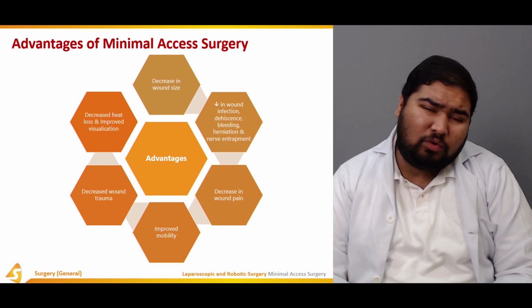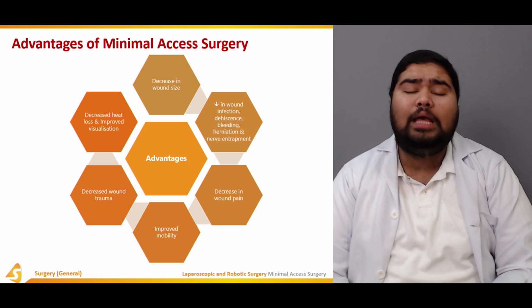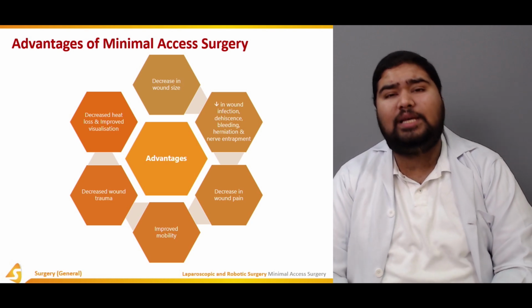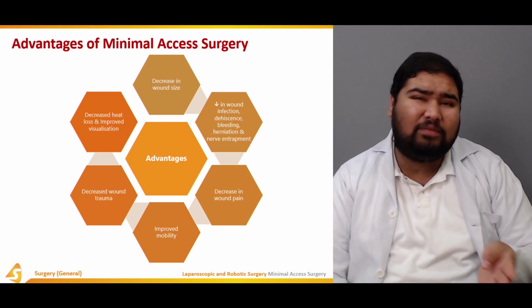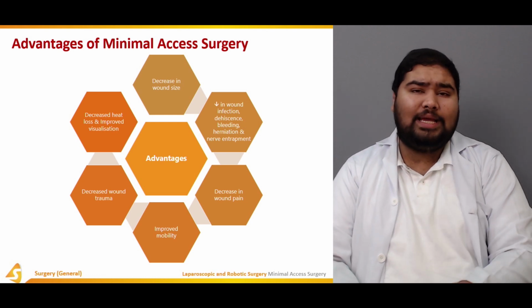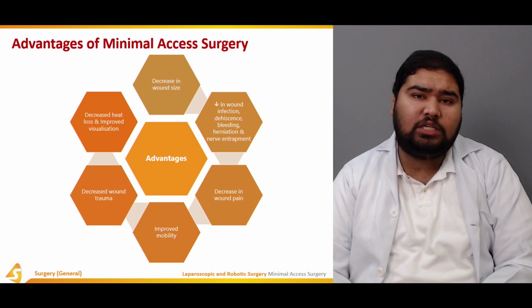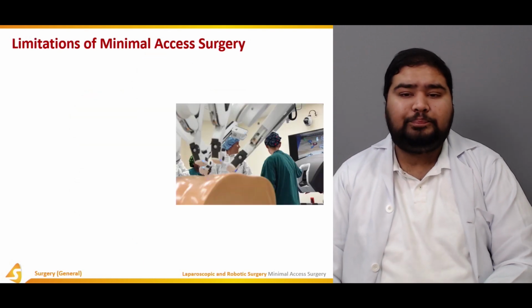So it's a small wound and the body is able to maintain itself, and then there's improved visualization because the probe is right there and you can clearly visualize what exactly is going on. So these are some of the advantages of the minimal access surgery.